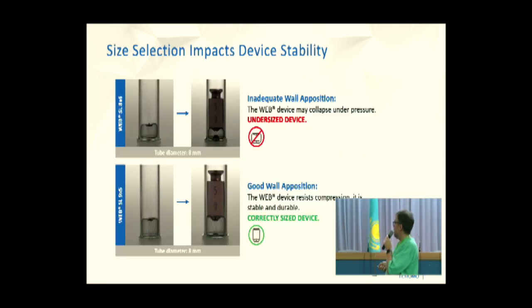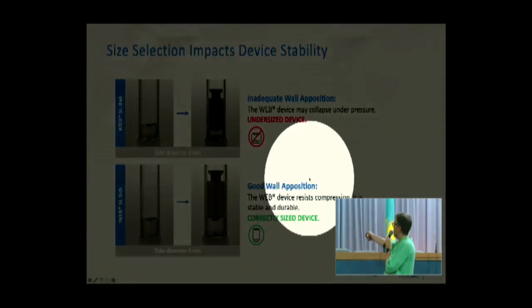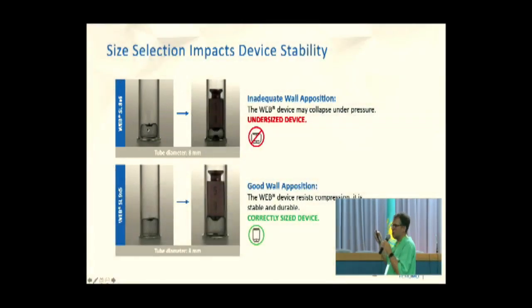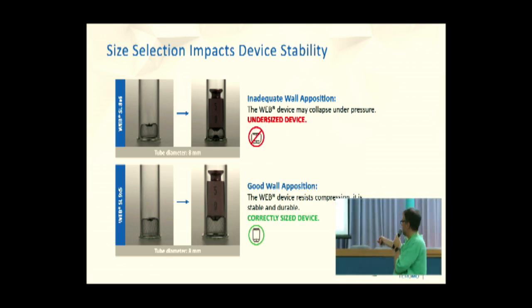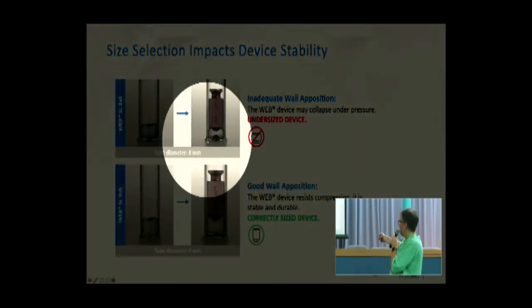So here's just an illustration. If you take care of the device selection chart, it does all the tricks for you. We have here a tube with 8 millimeter diameter. We put in an 8 millimeter web, a cork, which is not sufficient. If you put an 8 millimeter cork in an 8 millimeter bottleneck, or in your wine bottle, it's not going to work. It's going to plop out or inside the bottle. And the same thing is if you put some weight on it, you see compression.